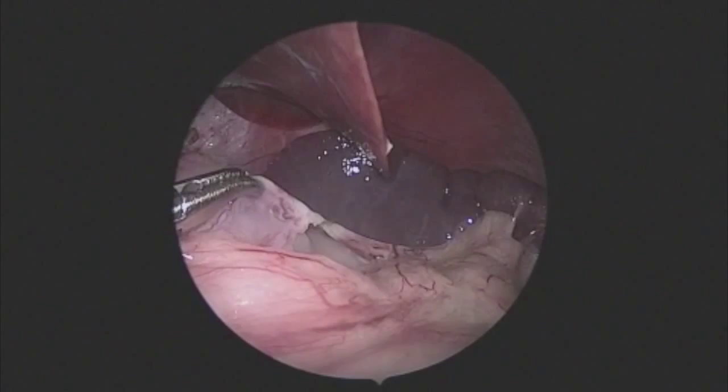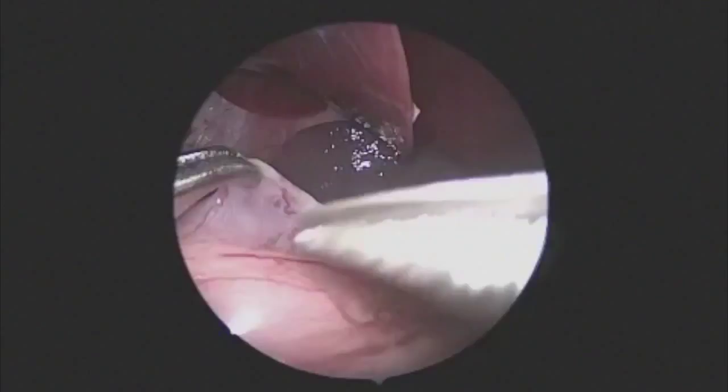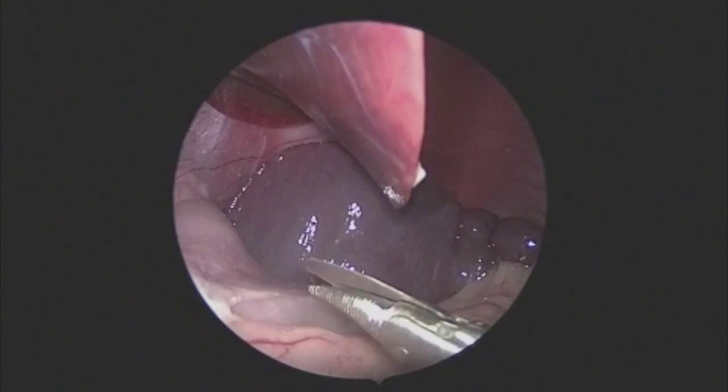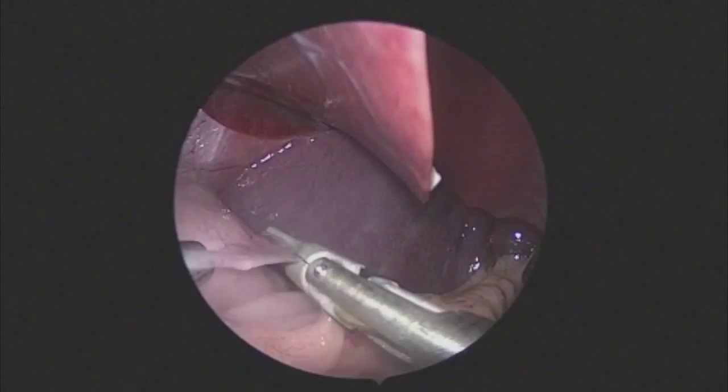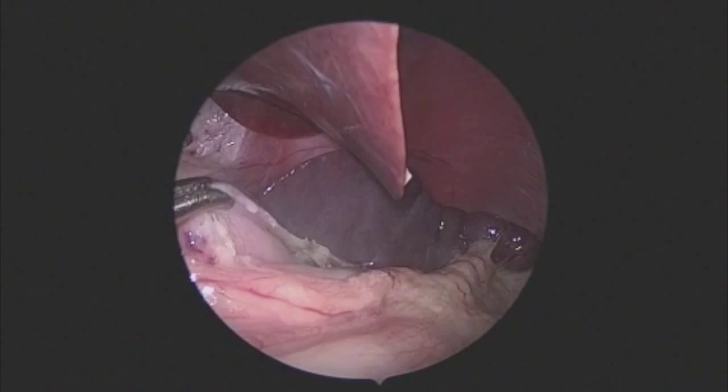Using a three millimeter sealer allows the right-handed port to be a three millimeter port as opposed to a five millimeter port used previously. This is an extremely safe technique which can be used well with residents and fellows as there is very limited energy spread. Another technique is to make two seals and then gently tear the short gastrics — with vessels one to two millimeters in size, that is very safe and hemostatic.